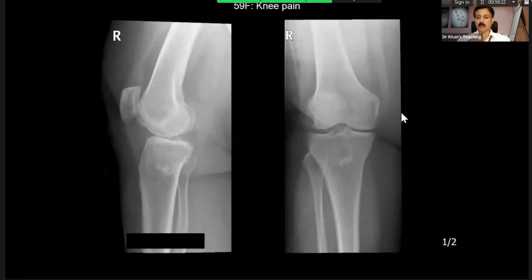First of all, pain, again just like osteochondroma, then comparison with old films. Then it will become lytic, so there will be endosteal scalloping, and the scalloping might involve more than 2/3 of the thickness of the cortex, and similarly in a craniocaudal dimension, more than 2/3 of the height of the lesion will be involved.